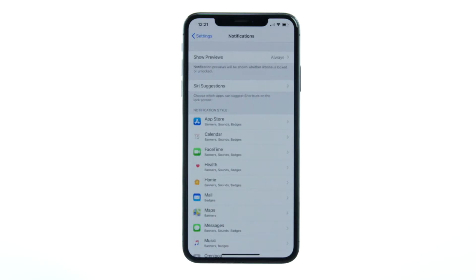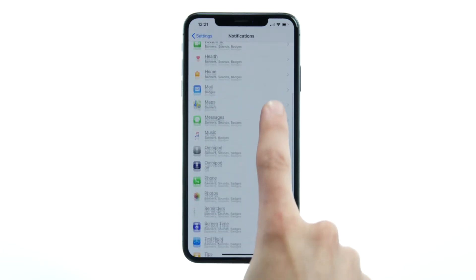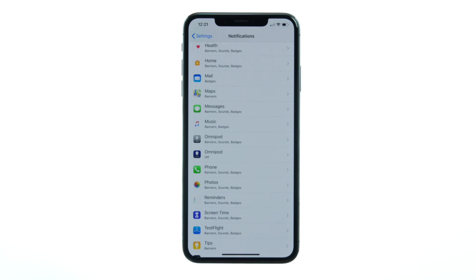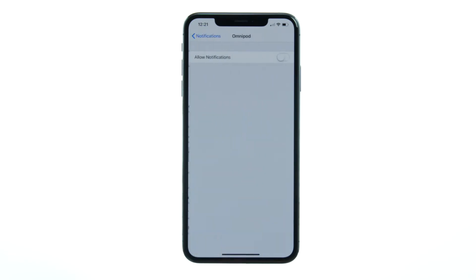Scroll down and tap onto the Omnipod Display app, then tap Allow Notifications.